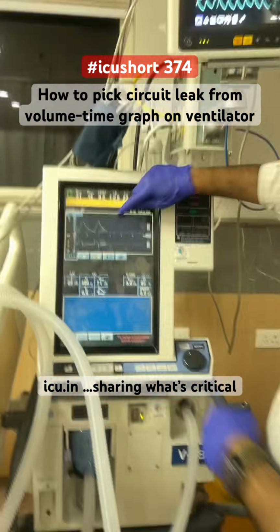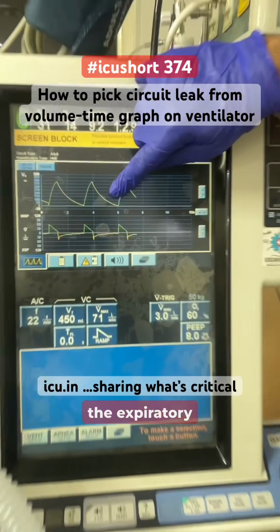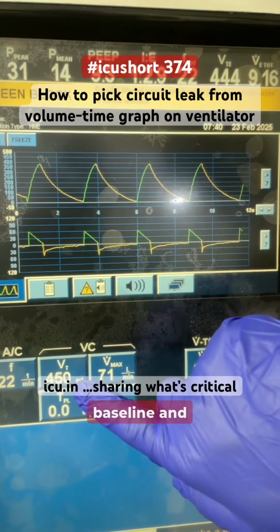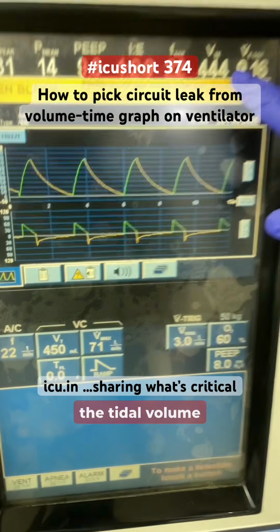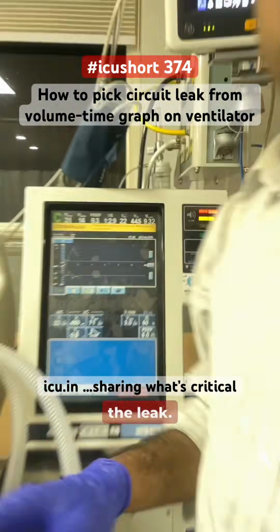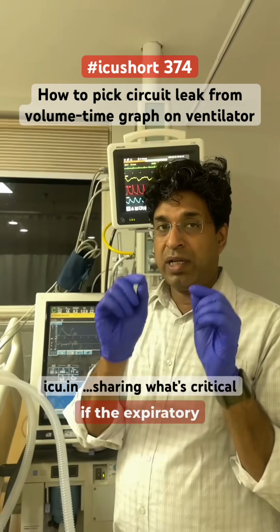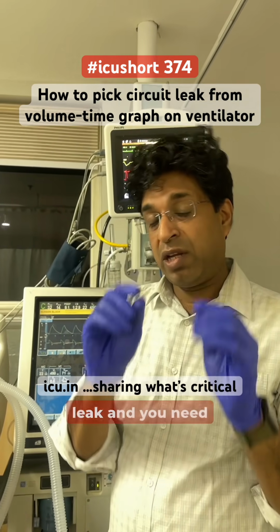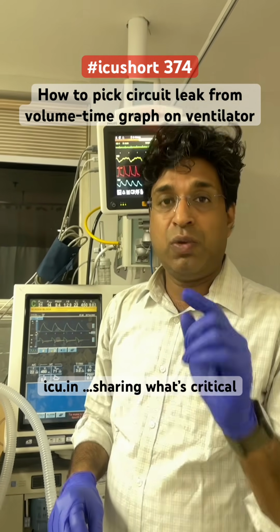Now you see that the expiratory limb is touching the baseline. And now the 450 is being delivered, so we have fixed the leak. So always remember, if the expiratory limb of the volume time scalar is not touching the baseline, there is some leak and you need to find the leak in the circuit. Do read more about it.